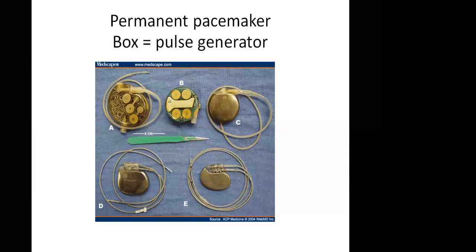If you have a surface pacemaker, why do you now want to go through the process of doing this minimally invasive, passing the minimally invasive temporary pacemaker?